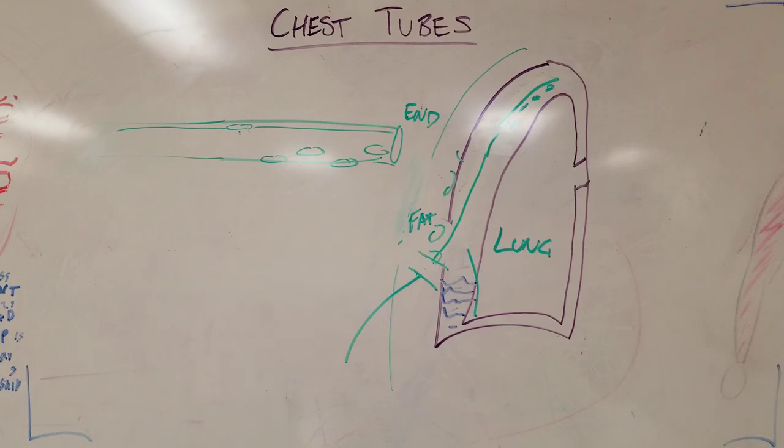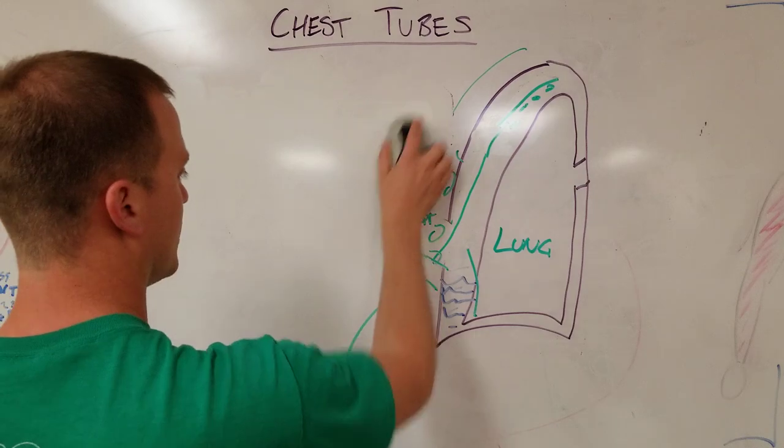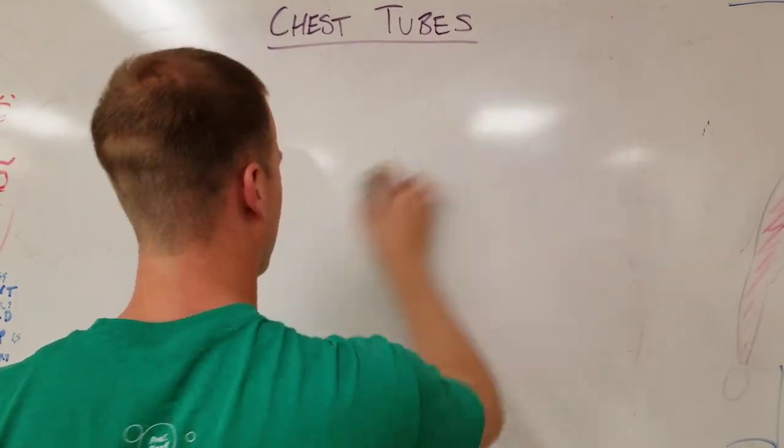It's not inside the lung. This might be contributing to an air leak. Your chest tube might be malpositioned. This is something that needs further attention with either replacement, observation, or a CT scan or something like that. In any case, that's kind of a quick guide to chest tubes and their location on chest x-ray and what you put them in for.